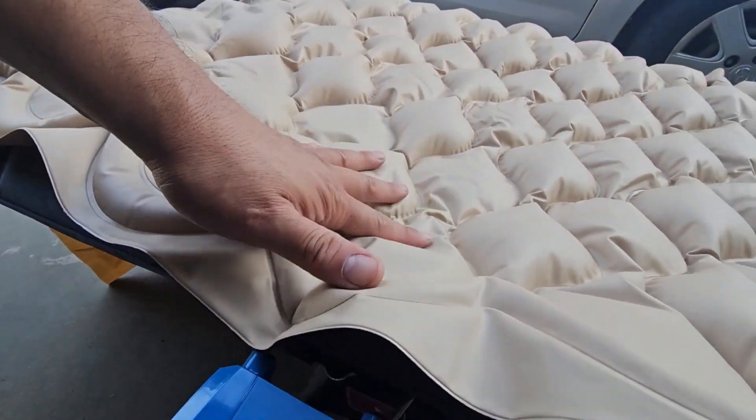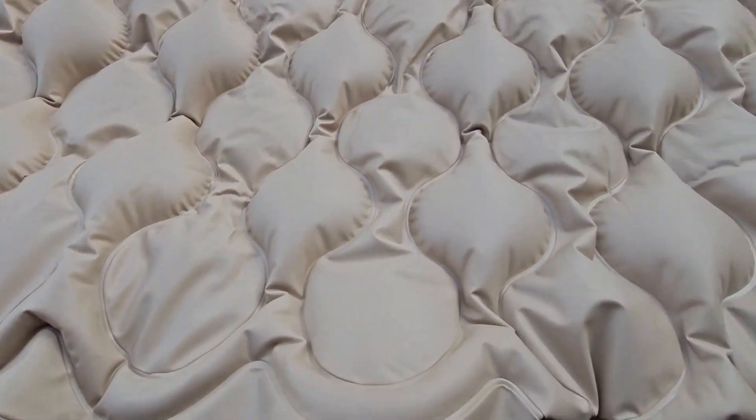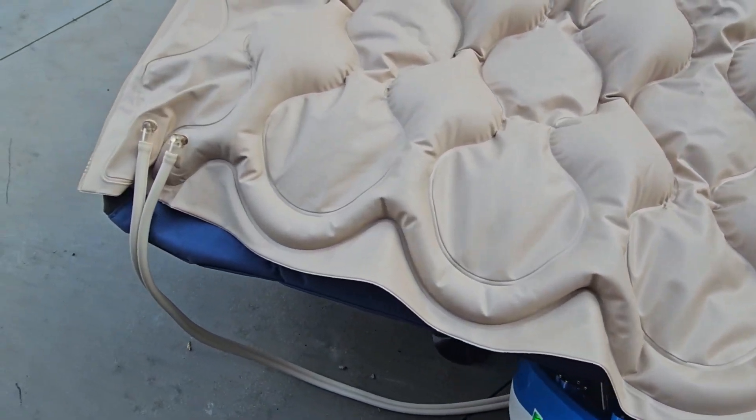Look at this — inflating the whole thing pretty good. It doesn't deflate; it keeps pumping. It's very quiet, very very quiet.